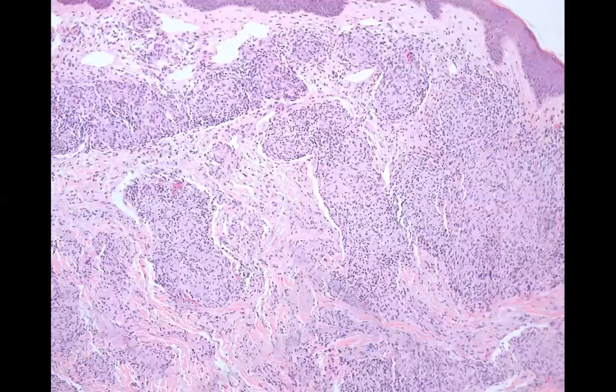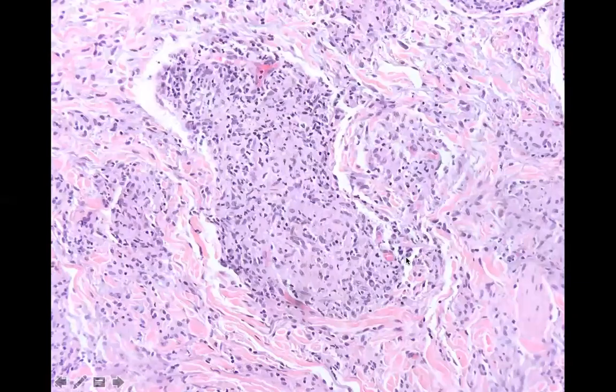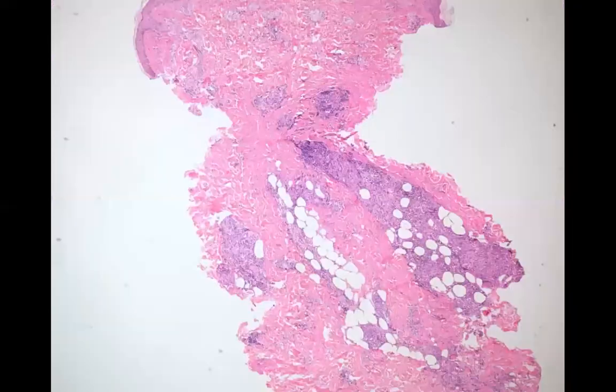All right, so let's take a look. So here we have a case where we see these elongated sausage-shaped granulomas, right? This still classifies as a nodular granuloma, but rather than being individual circles, they're kind of conjoining together. So that's one clue you might be dealing with leprosy. And then the presence of lymphocytes here suggests that maybe you're not dealing with a naked granuloma, but as I emphasized earlier in another lecture, sarcoid is not always naked, so you can't hang your hat on that, which is why for any case you're going to rule out infection.